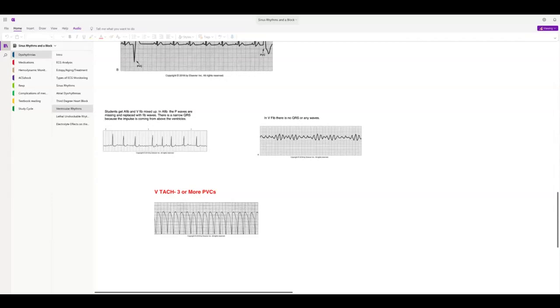I've had some experience with it. It's confusing, right? Because you've never seen it. Have you seen it before? Yeah, looking at it in person, it makes more sense because you have to make sure that it's level so that you can get the right readings that you need for that particular patient.